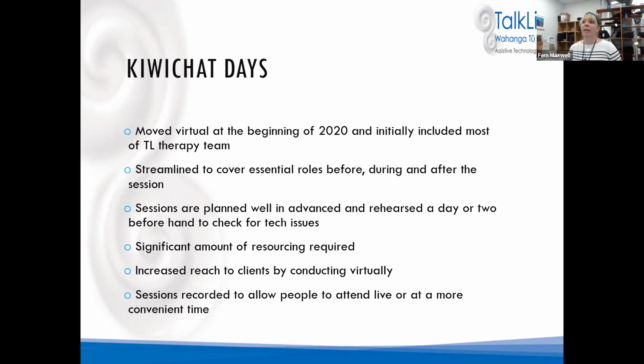In the regions in particular, we've used Kiwichat days in the past to support people who are waiting on our wait list, and so having a bank of recorded sessions really helps. What we can say to people is, if you're wanting to see how this works, if you were reading a story, how you would use your call board, if you're wanting to ask questions, how you might use your communication device, go on to our Kiwichat day and watch the session, and they can actually do some learning there as well. So we are seeing that as a resource for those on our wait list as well.